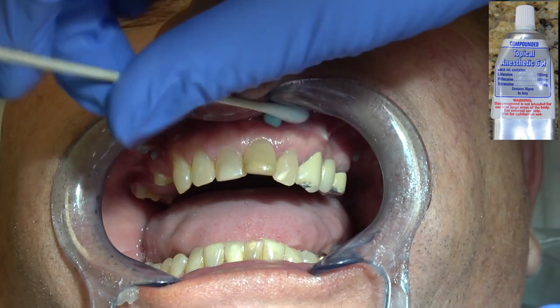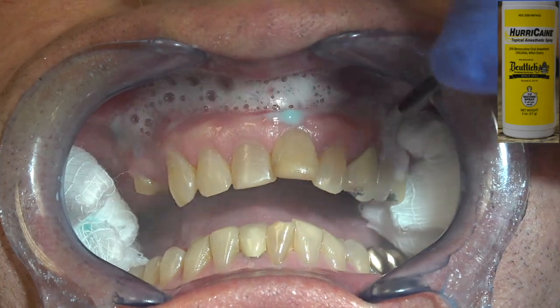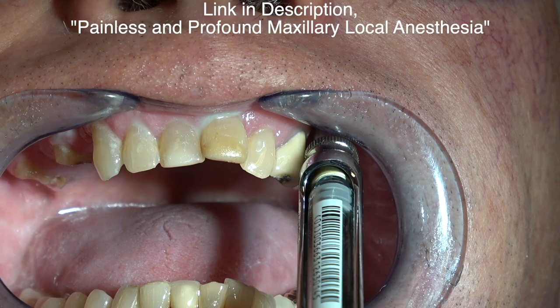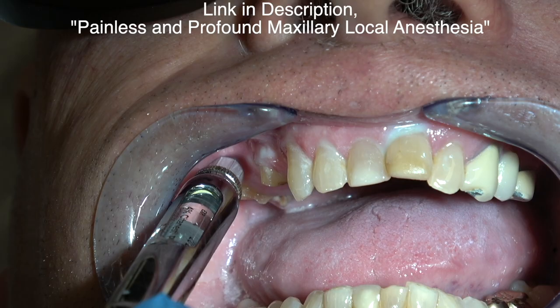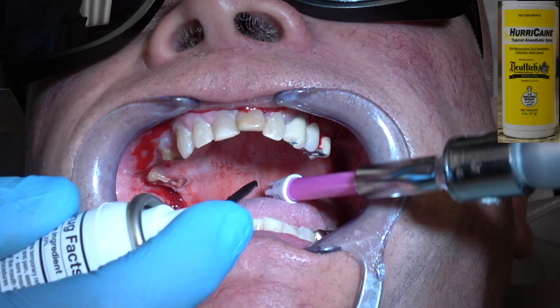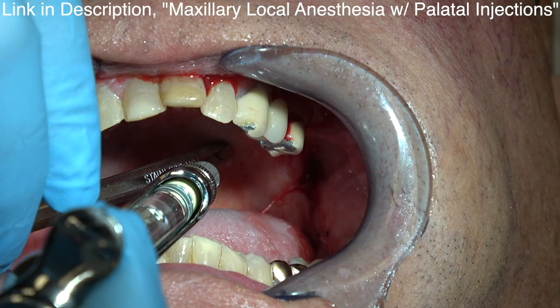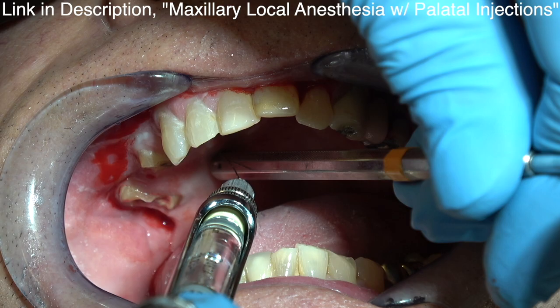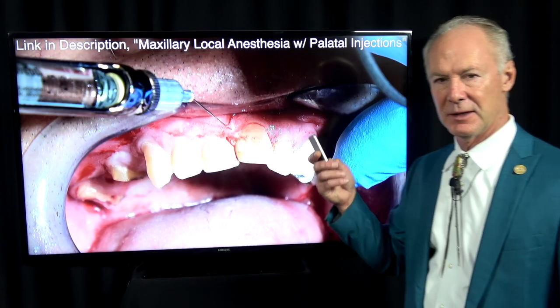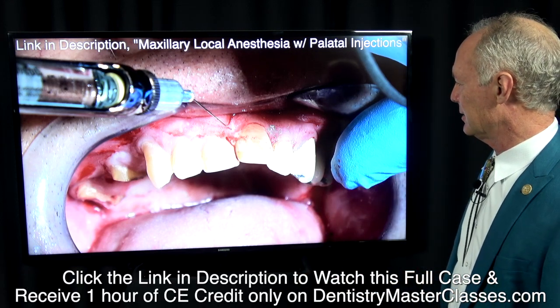You can see the missing teeth over here on the right. There's an old leaky bridge and broken-down teeth here. Only the anterior teeth were really savable, and the restorative work in the posterior would have been so significant and costly. When you're thinking about whether you can achieve a good cosmetic and functional result, it was obvious the best answer was to extract the teeth and place an implant-supported removable or fixed appliance. The patient was good with a fixed appliance.